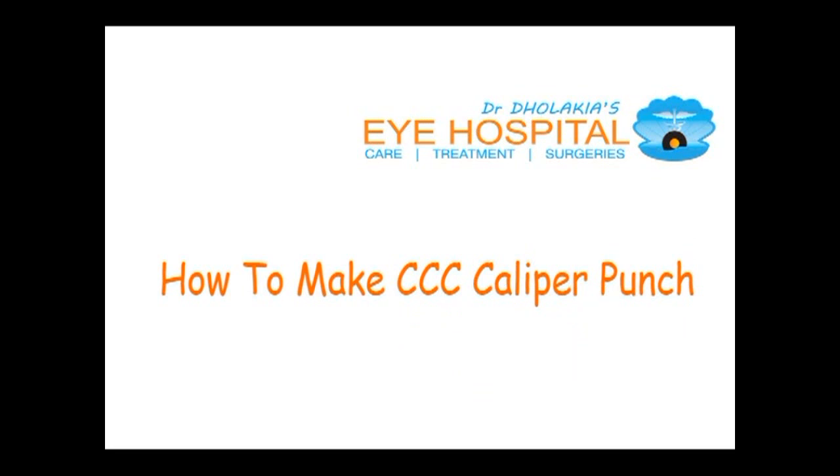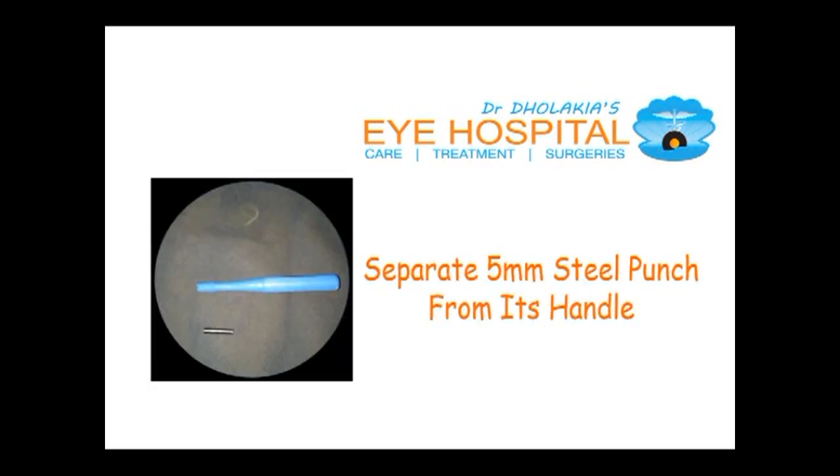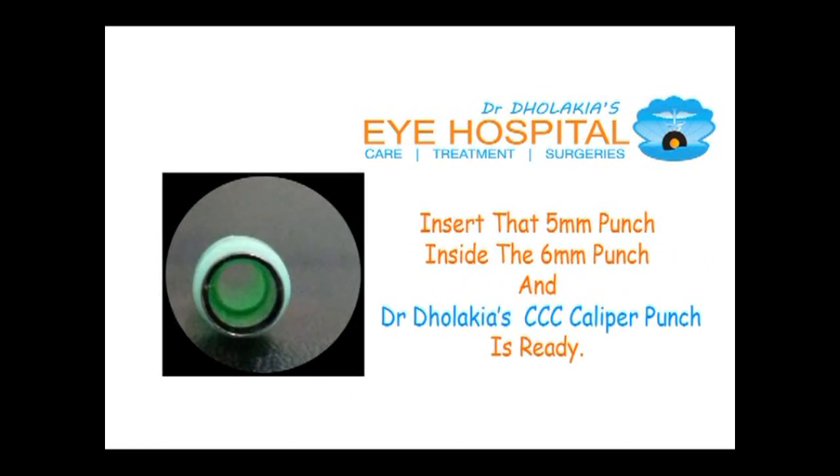Let us see how to make the CCC caliper punch. You need to separate the 5 millimeter steel punch from its handle — it is easily removable. Then insert that 5 millimeter steel punch inside the 6 millimeter steel portion, and your CCC caliper punch is ready.